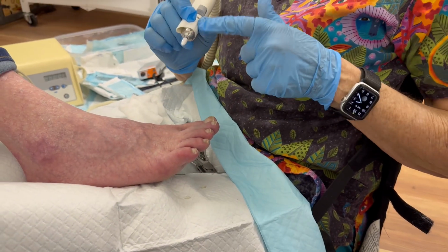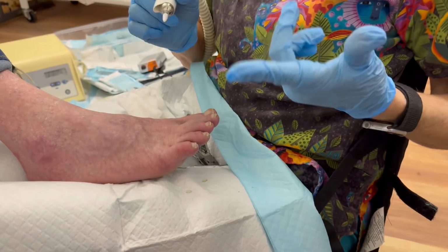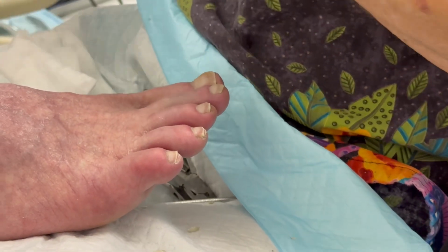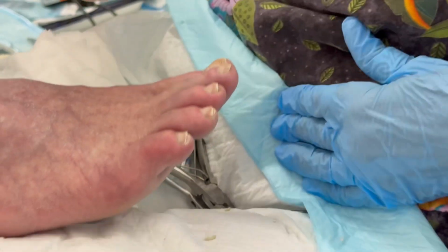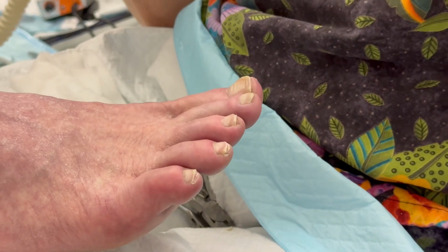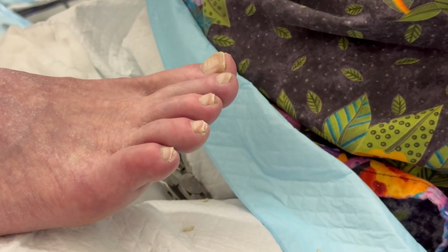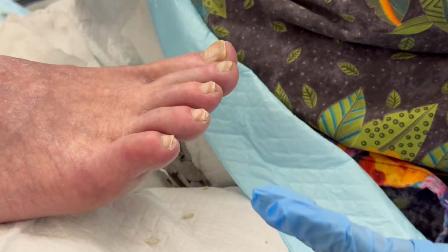Even with this, you should still wear a mask, but I'm not because it's just so hard. Posture, poise, and comfort. So: headlamp, magnifying glasses, stadium seat, foot in lap, puppy pads.